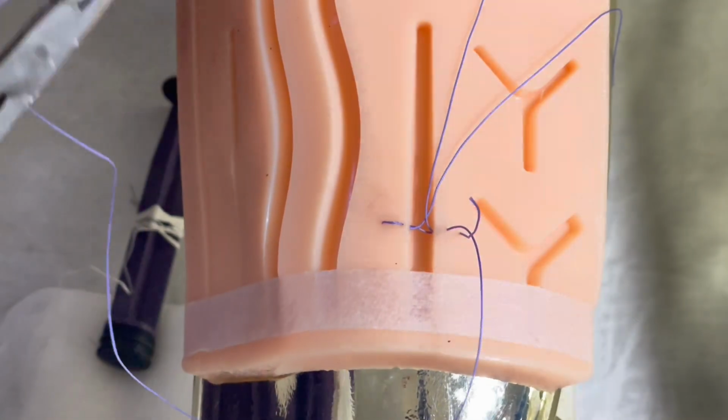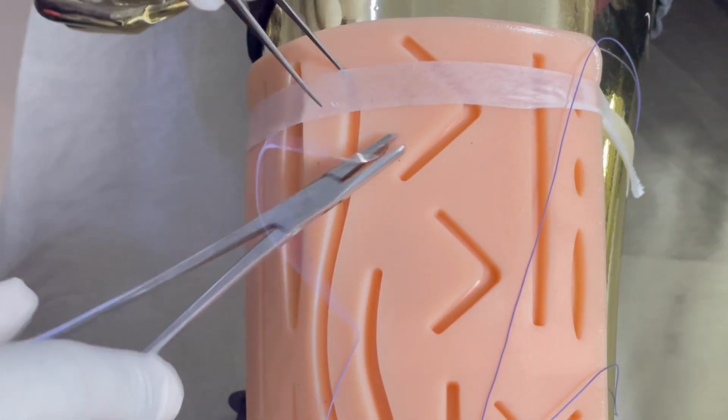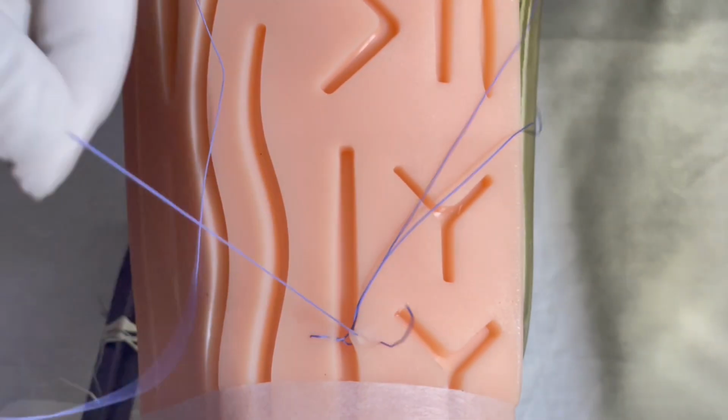If you have a long length, you just keep this secured at the pad, and these are the two ends.